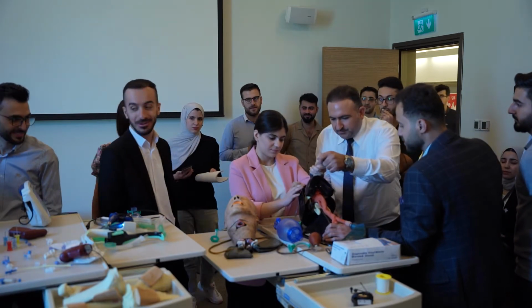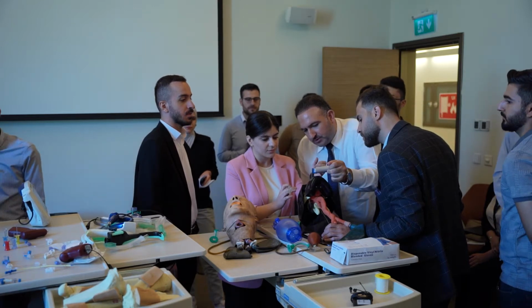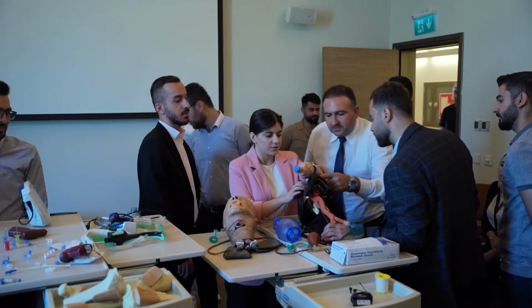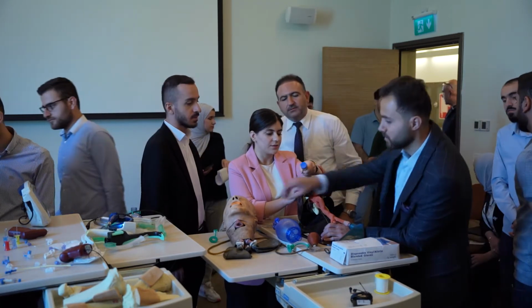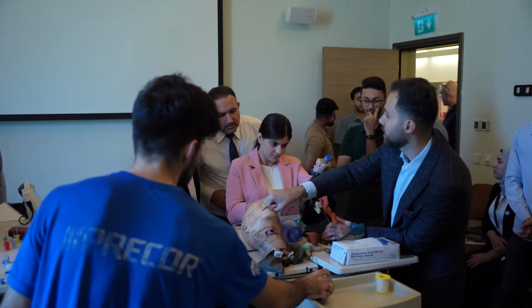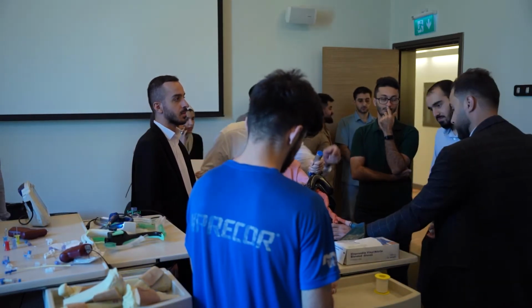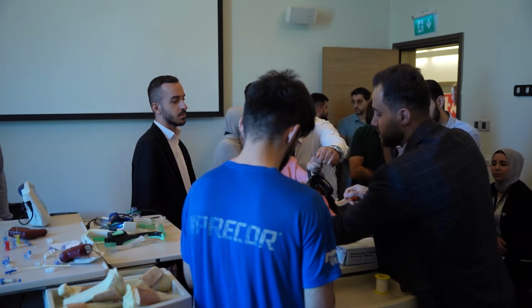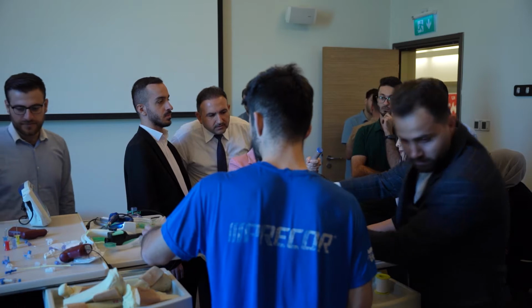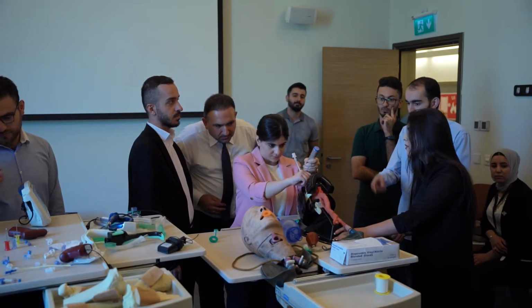What you told me, when you go in that way, then put the balance. See, this is the group work. Pressure on the teeth.